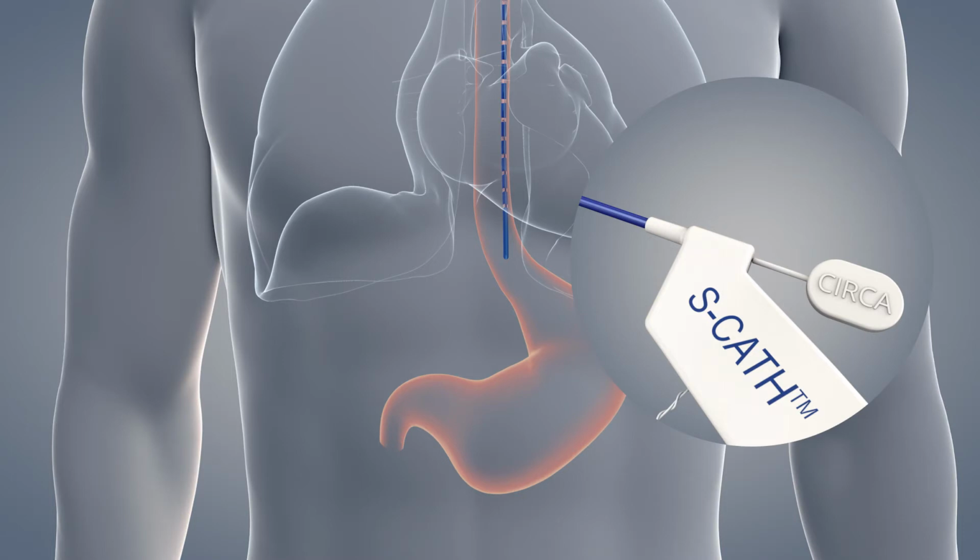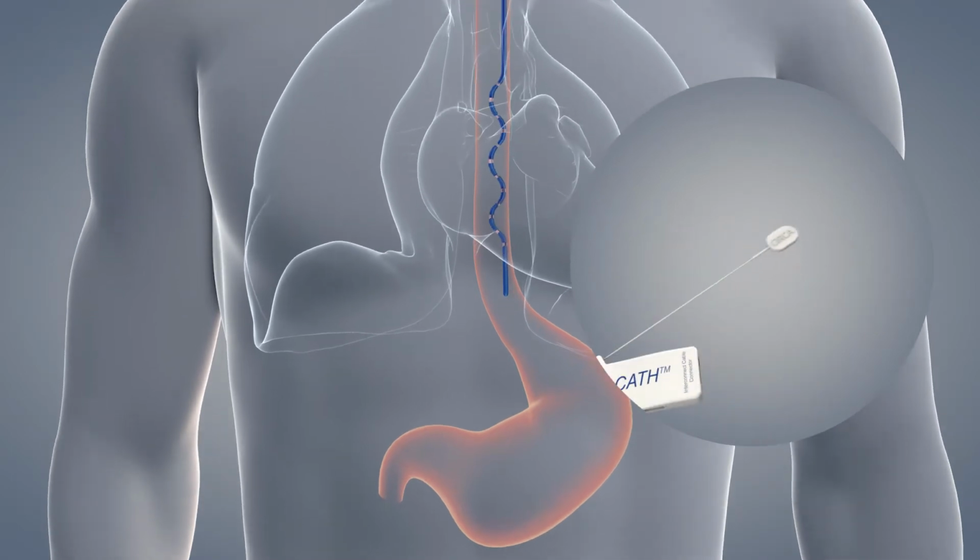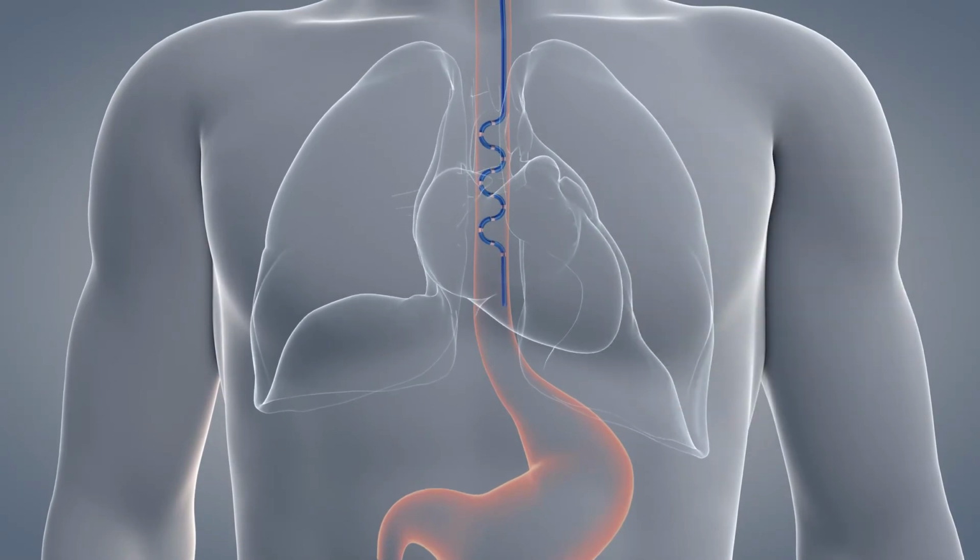hand grasp the end of the stylet and remove it completely. The probe will shorten as the stylet is removed. Do not reinsert or advance the stylet while the probe is in the esophagus. Discard the stylet. Please note, do not attempt to reinsert the stylet into the S-CATH or attempt to override the lockout feature, as probe damage may occur.